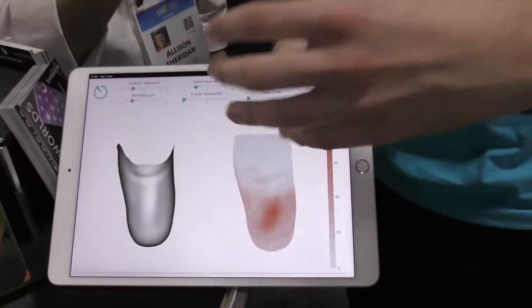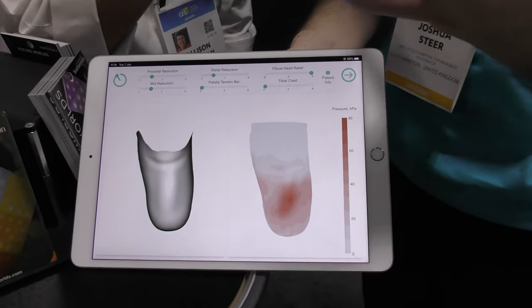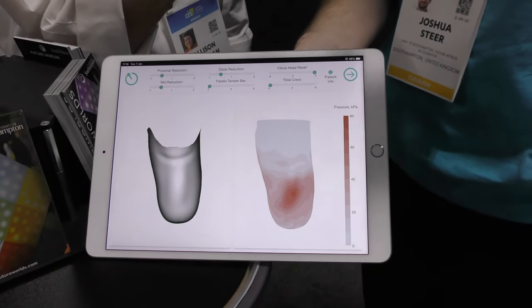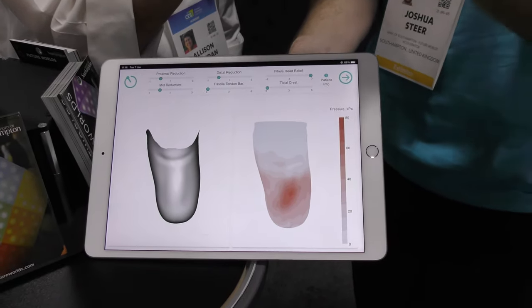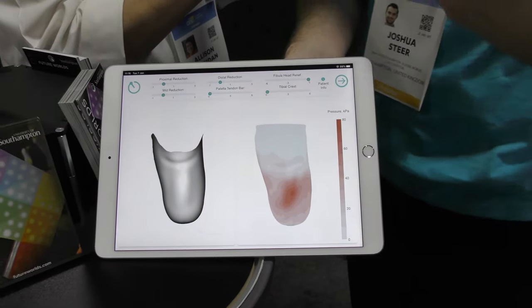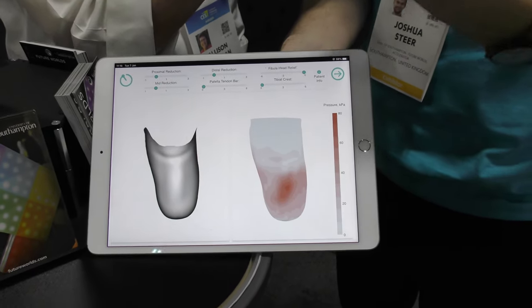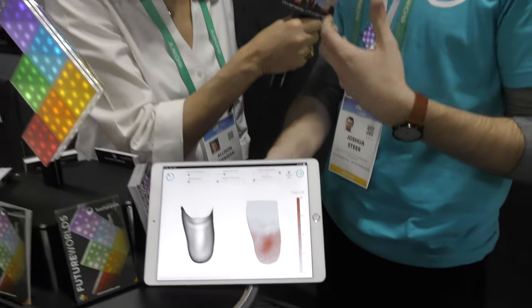So we're looking at an iPad here — I'm going to describe a lot of stuff because it's for audio as well as video. On the iPad screen we essentially have two models. The model on the left is the design of the socket — that's actually what the shape of the final device will be. On the right hand side we have a model of the person's limb, and across it we have a map of the different pressures — it's essentially a heat map. The darker the reds, the more pressure that's predicted in that area. The idea is that we can actually change the shape of the device and then in real time it predicts whereabouts the pressure will be redistributed to.